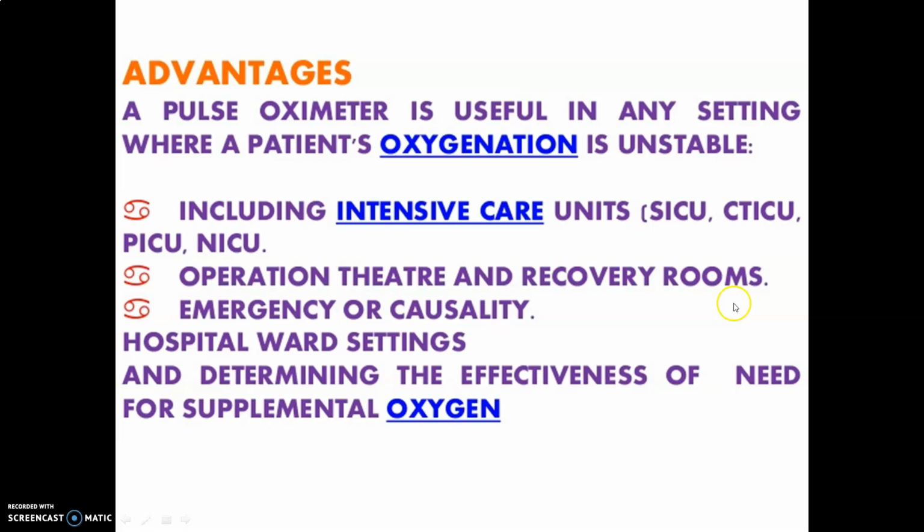Okay, operation theater and recovery rooms. Yes, absolutely. During operations, and right after operations, when we keep the patients in recovery rooms, there also we have to check very frequently to know the patient's saturation level.